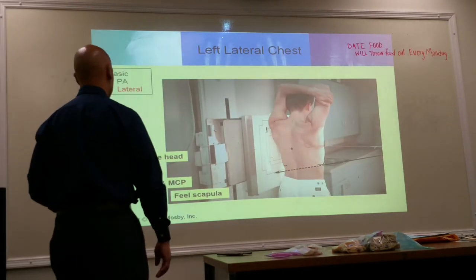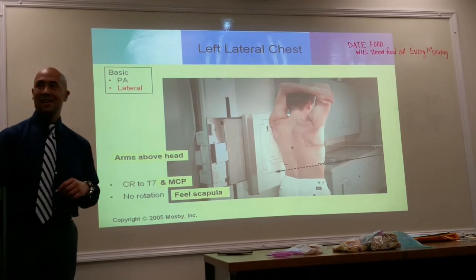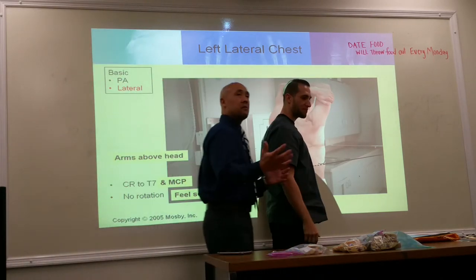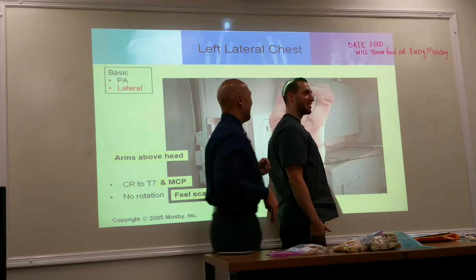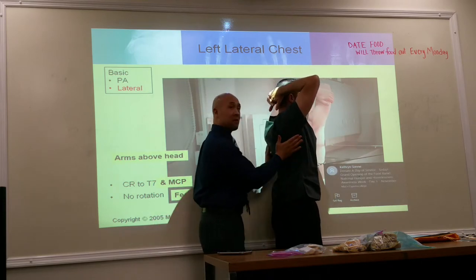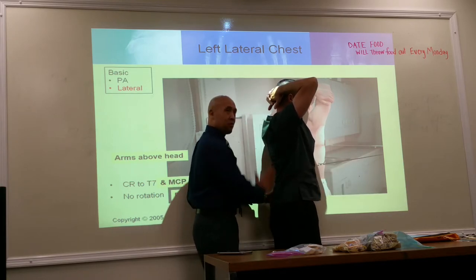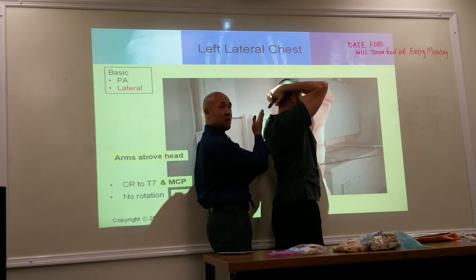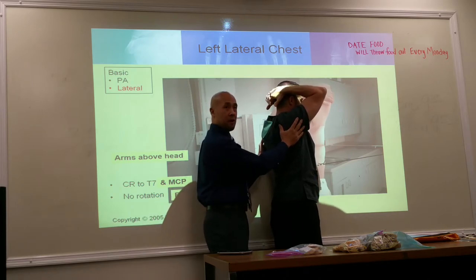Need another volunteer. Nick, you're up. Mandatory volunteer. Okay, let's have you up here. Ms. Jones, I need you to push your hands on top of your head. Top of your head, elbows together, chin up. Then I'm going to place him up on the board, but no tilt. I don't want to push this in. He's going to be perpendicular, straight up and down. Elbows together. His elbows out is going to create greater OID, so I have him put his elbows together so he's closer up to the image receptor.